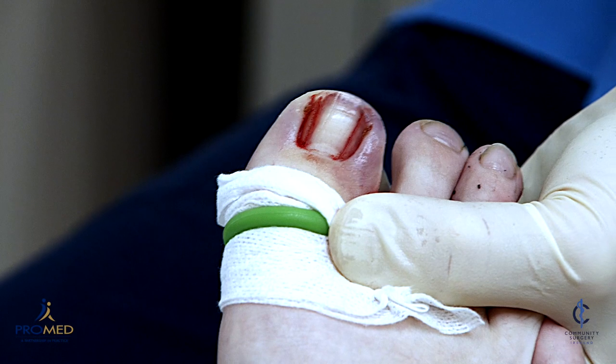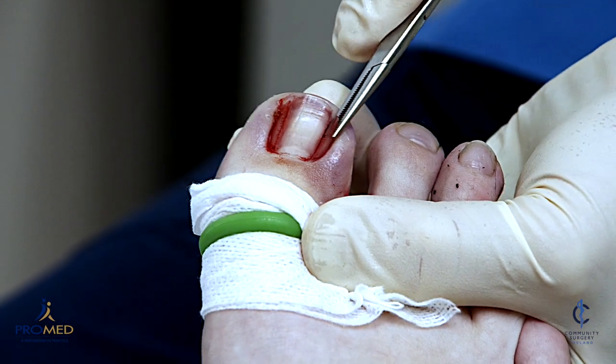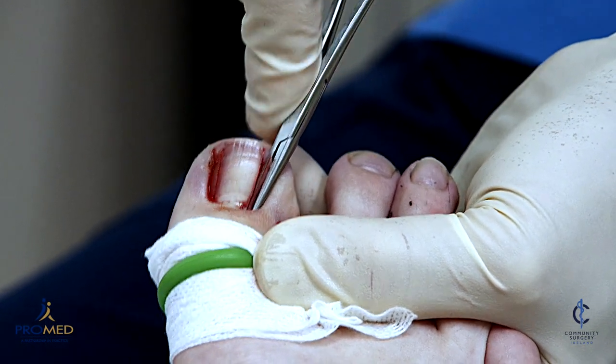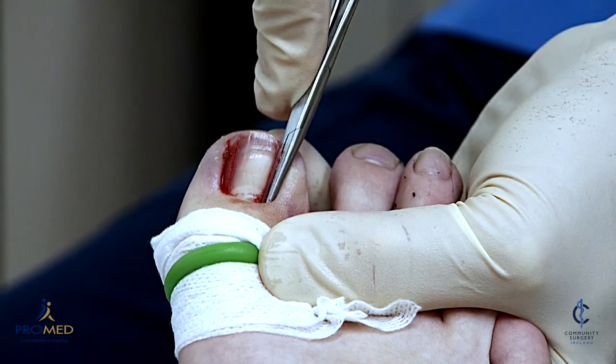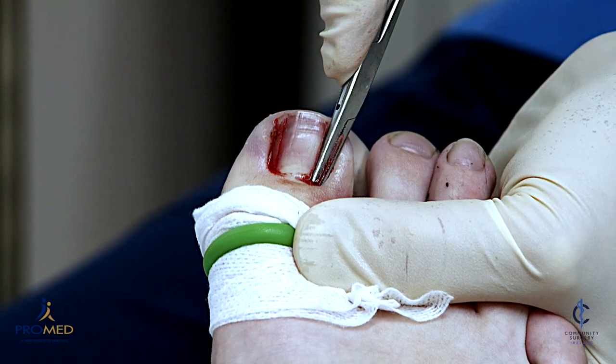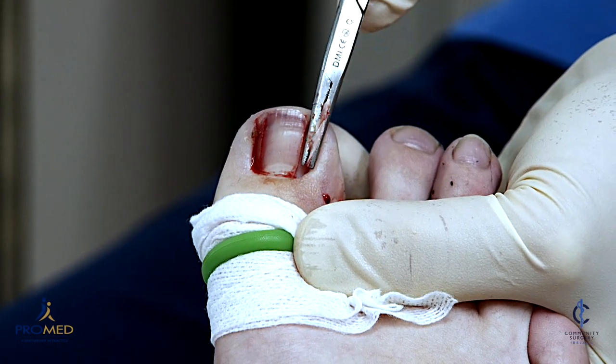We lift off the nail — get in under the nail, right down to the base, and then twist it like you open a can of sardines. Just be careful not to lift the nail that's left behind — only lift the bit that's coming out.